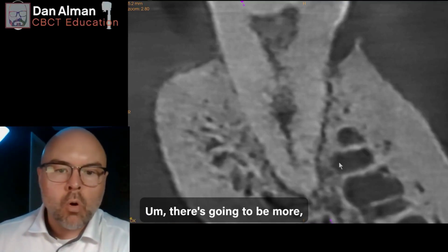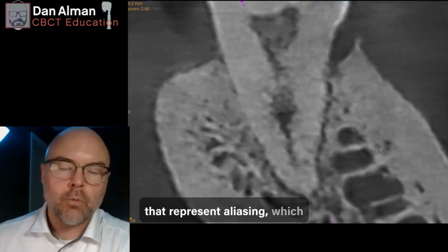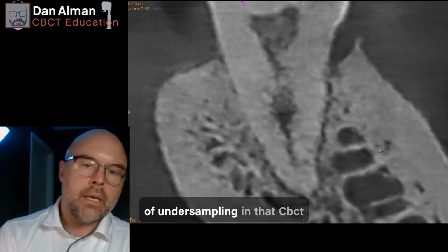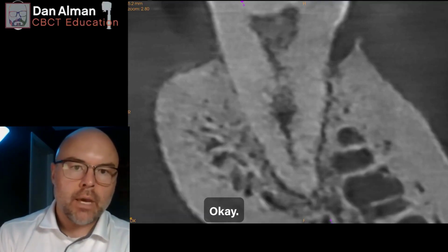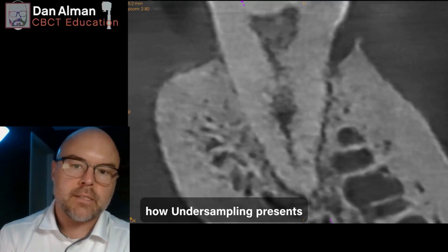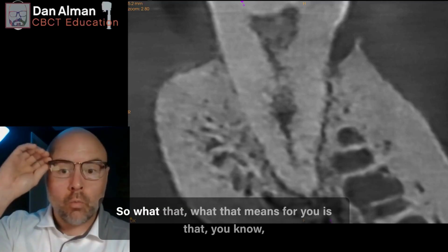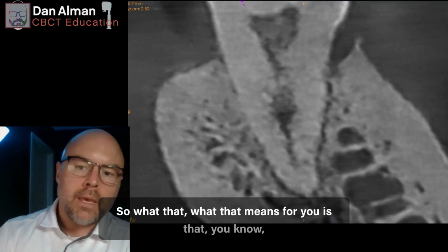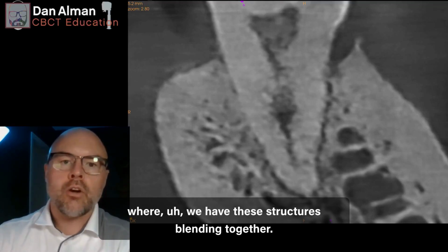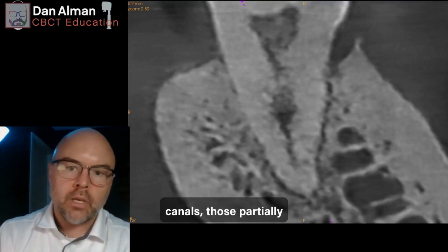You're going to be able to visualize more of the lines that represent aliasing, which is a direct result of undersampling in that CBCT scan. Okay, aliasing artifact is how undersampling presents. Blending artifact is how undersampling presents. So what that means for you is that where we have these structures blending together, you're not going to be able to see those narrow canals better, those partially calcified canals.